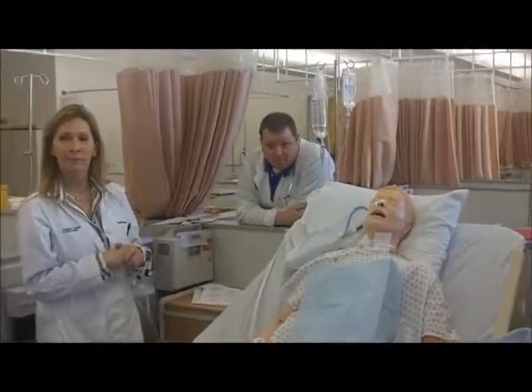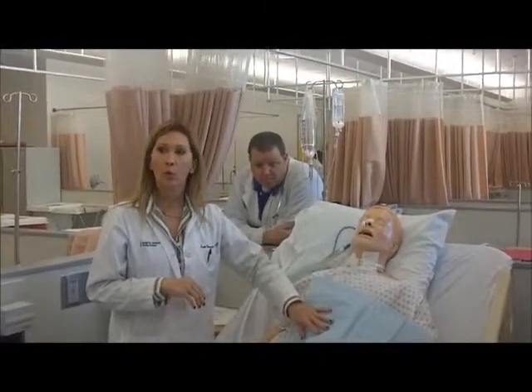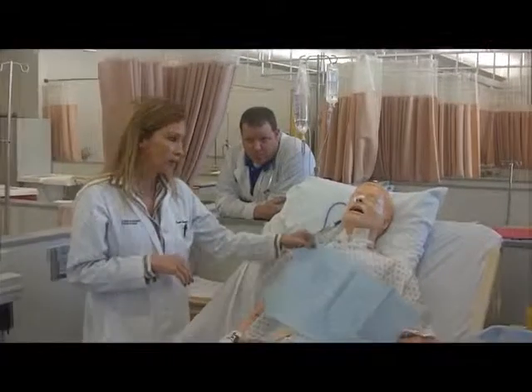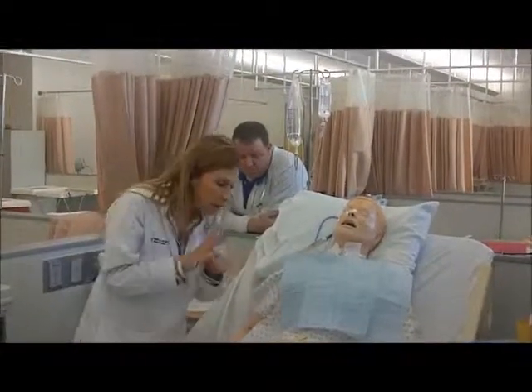When you auscultate, you're just listening for normal bowel sounds? When you're auscultating, you're listening to make sure the placement is in the stomach, like a whoosh. Just a whoosh, okay. Yeah, you'll hear it. If you don't hear it, or you hear it up here, it's probably not in place correctly. Okay. You need to hear that push.